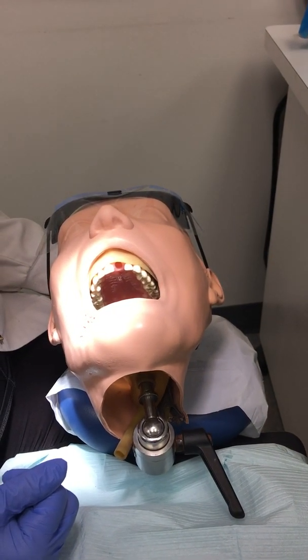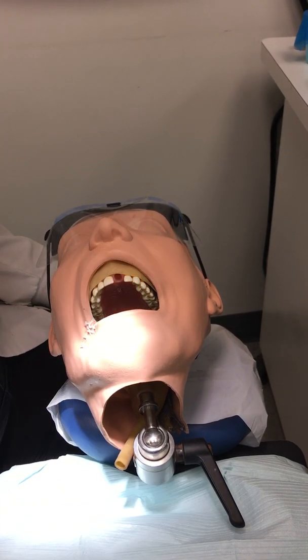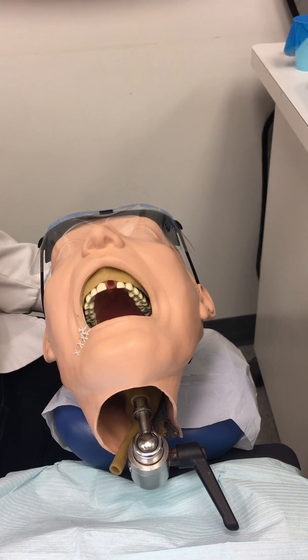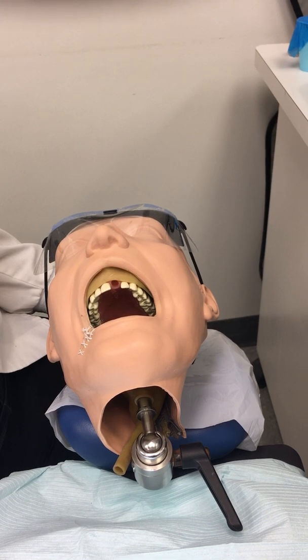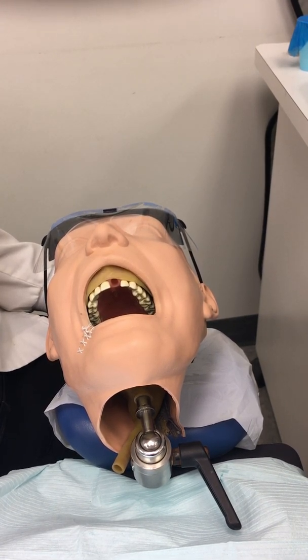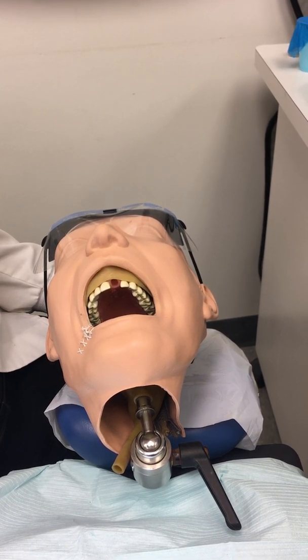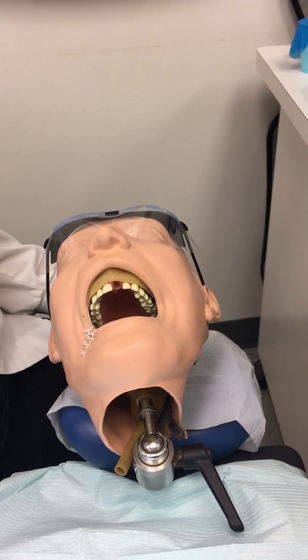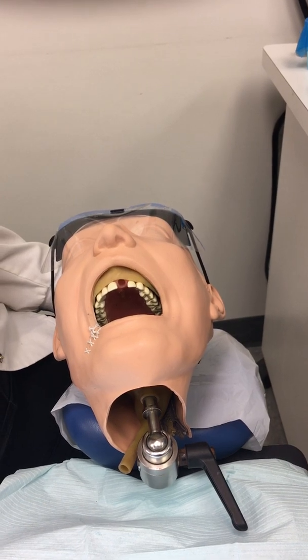Give post-op instructions: explain they may be numb for two to four hours. A soft diet is recommended because the patient could bite themselves and not know it. Chew on the opposite side of the mouth until they get their permanent restoration. The tooth is no longer vital and can become brittle and break. Slight discomfort for a few days is normal; if it's more than that, please call the office. Document the procedure and dismiss the patient, making sure they schedule their next appointment for a crown prep or permanent filling.